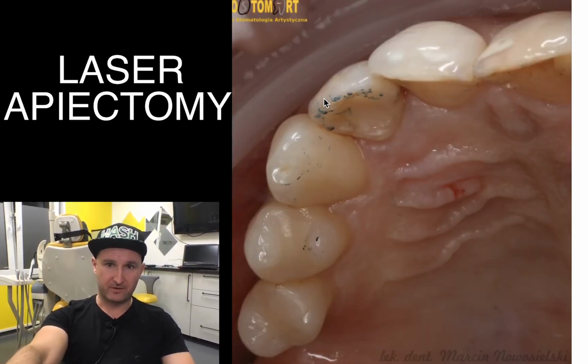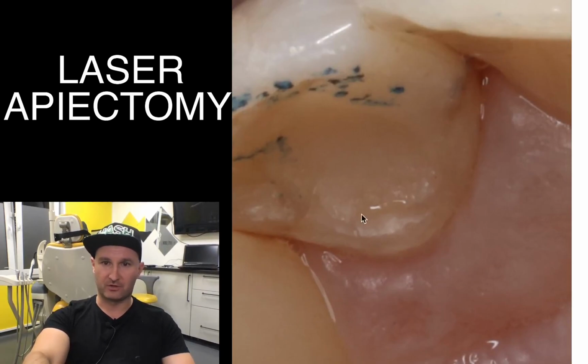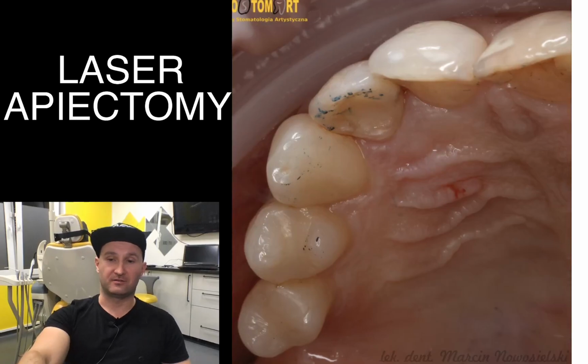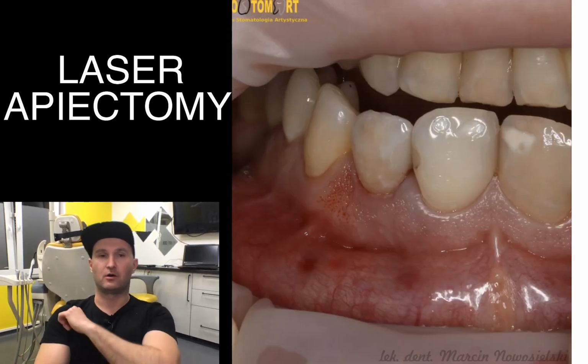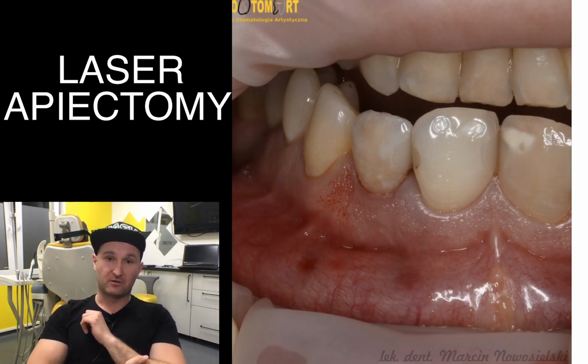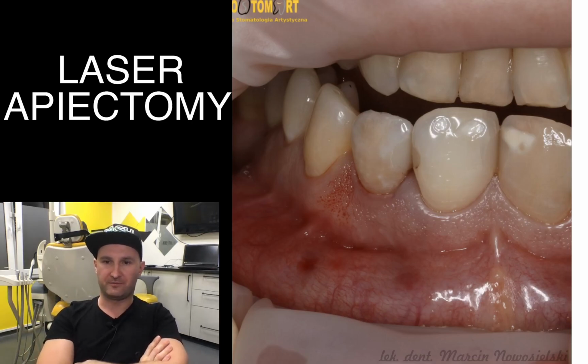After that we filled the chamber with the new restoration, and since the removal of extruded gutta percha was not successful, we decided to perform the other part of treatment, which was supposed to be the surgical part, the endodontic microsurgery.